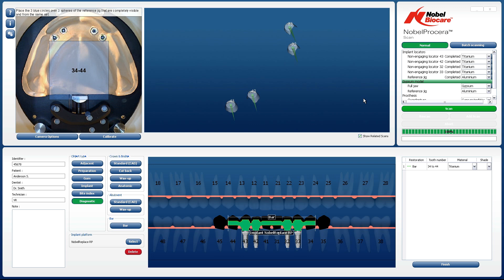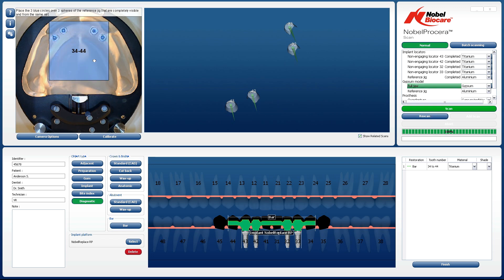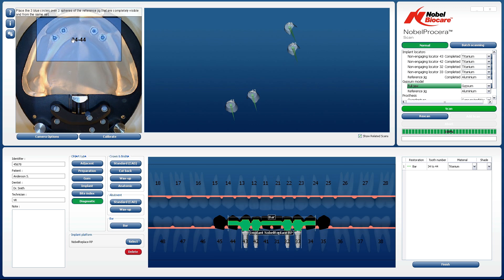A box will now appear in the Camera View, and this selects the scan area of the model. The next stage in the scanning process is the scanning of the model. If the model has removable soft tissue replication material, this needs to be placed back onto the model carefully. The box can be positioned or resized by using the left mouse button to drag. Make sure that all the important aspects of the model that are required for the CAD design are recorded at this stage.